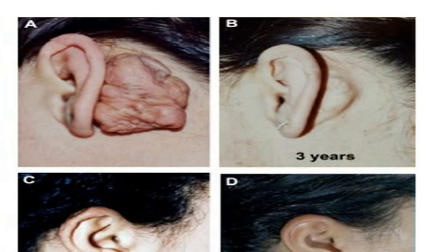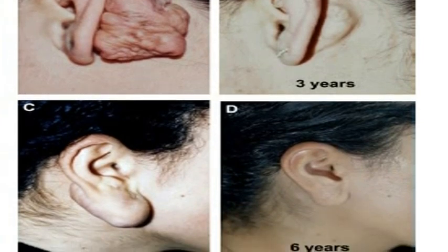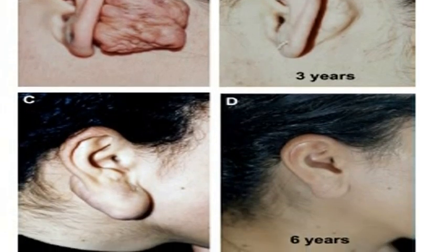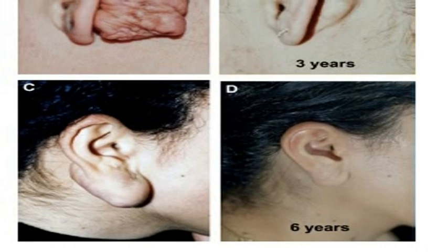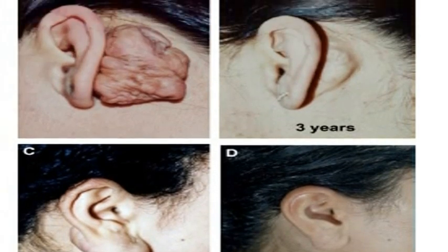Figure 4. Result at baseline, A and C, and after 3 and 6 years, respectively, B and D, post-intralesional cryotherapy. Adapted with permission from Harshai Y, intralesional cryosurgery for enhancing the involution of hypertrophic scars and keloids: a new effective technology based on experimental and clinical data. Journal of Wound Technology.